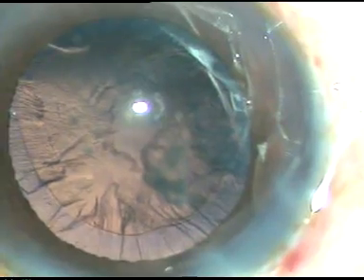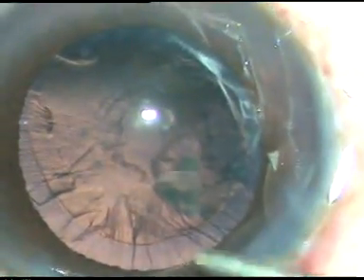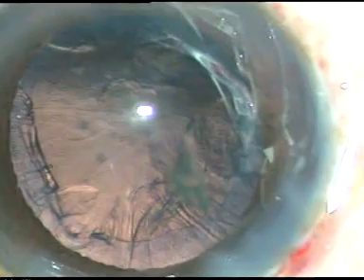Now this is the epinucleus — it is just flipped and came out in a second. Now the cortical matter is to be removed. This can be removed beautifully by manual irrigation-aspiration or coaxial irrigation-aspiration. I usually use this very simple instrument, a Simcoe cannula.